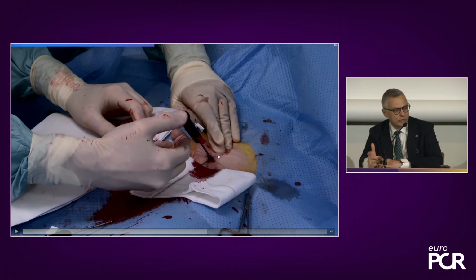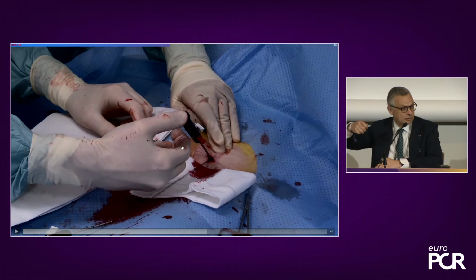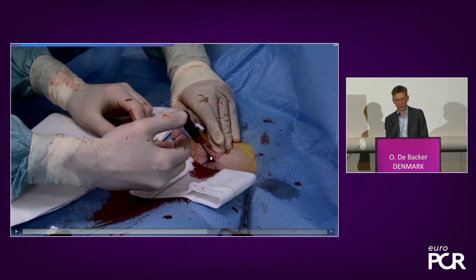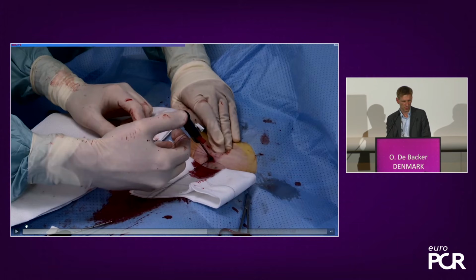Yeah. So always have this concept that you are actually doing something that is somehow magic, because you have only 1 or 2 sutures to close an arterial opening, which usually requires in surgery 10, 15 sutures, and this is done. You see, this is the correct way to take it, yes, as Francesco described. So you pull the long one around your digit finger, as it is here, and then you have the best tactile feedback if you use the thumb for the pushing on the knot pusher.